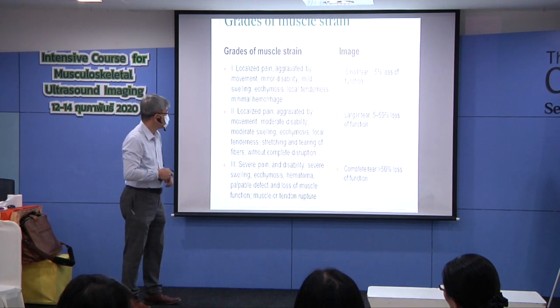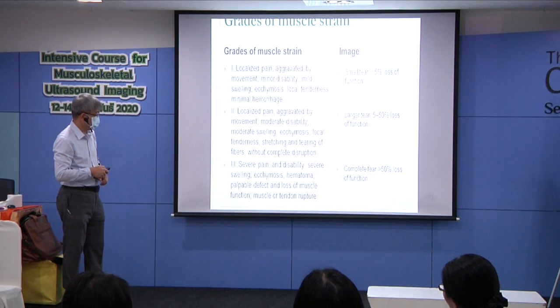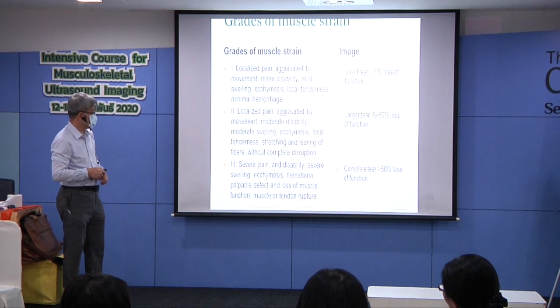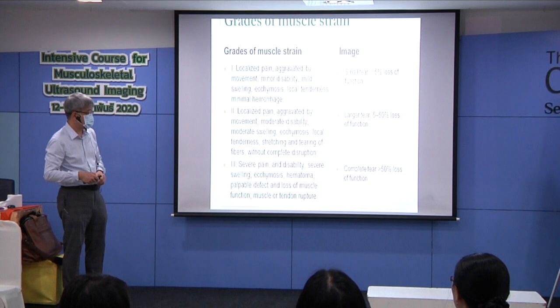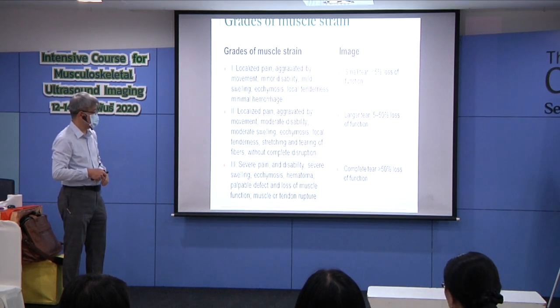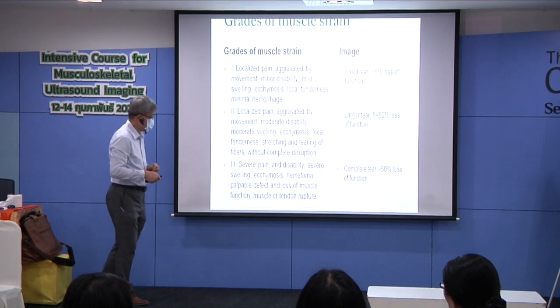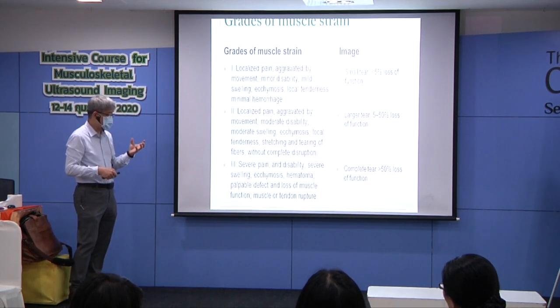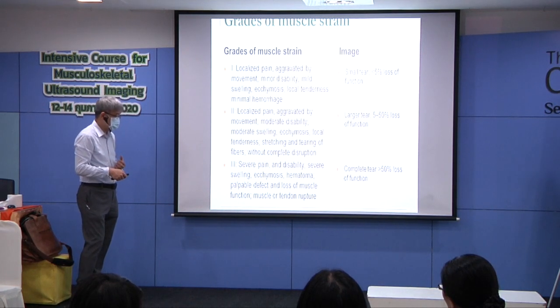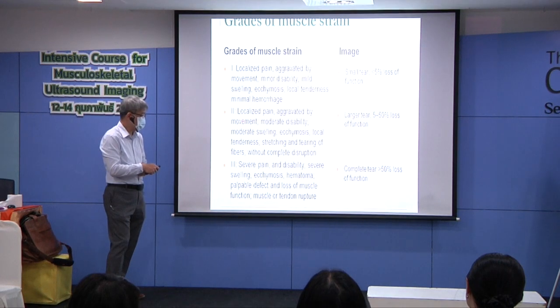It's okay. This kind of pain usually does not stop people from doing functional activity, but they feel the pain increase when they are doing sports. Our job is to use taping or wrapping to reduce the gap of the injury and also protect the person from recurrent injury or enlargement of the gap. If the muscle injury is found with a very obvious hypoechoic area and swelling, and stretching induces the pain, you probably can talk to your colleague.